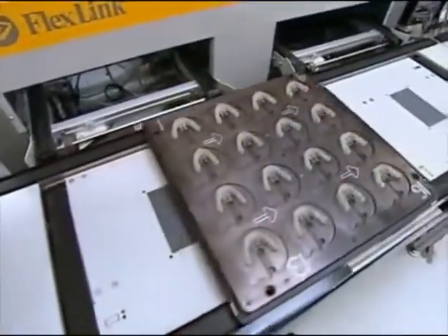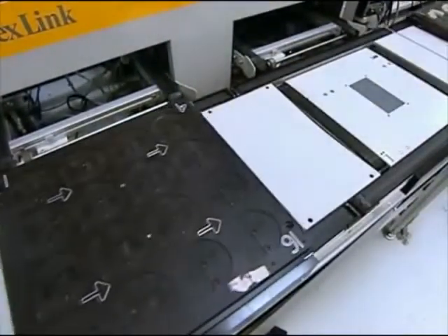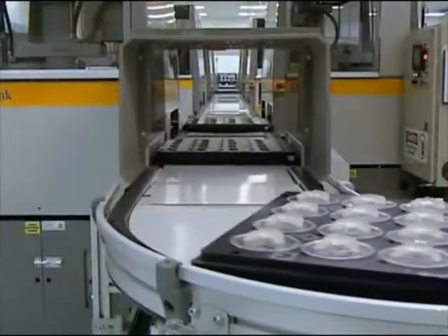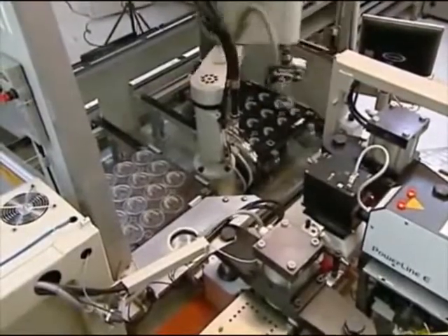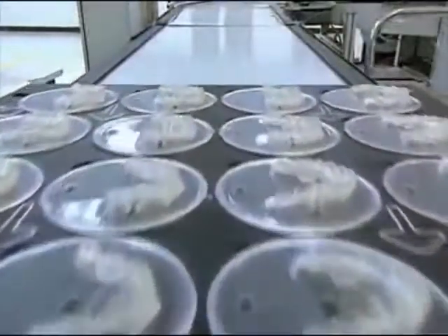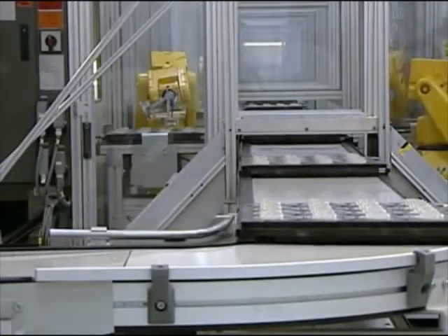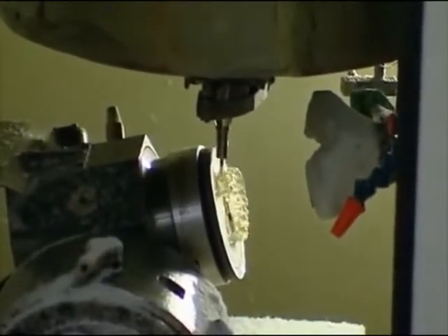The models will now go automatically down the conveyor system to various manufacturing processes. Another tray comes in, reloads, and the process continues. As it moves on the conveyor, it goes through a number of different steps, such as the forming and marking operations, where we actually thermoform the polymer over the aligner mold. The newly formed aligners are then released to the trimming function, which relies upon virtual data that you approved in your ClinCheck to trim the gingiva line. In real time, the machines automatically pull up that approved treatment data so that we can cut each aligner to your specifications.